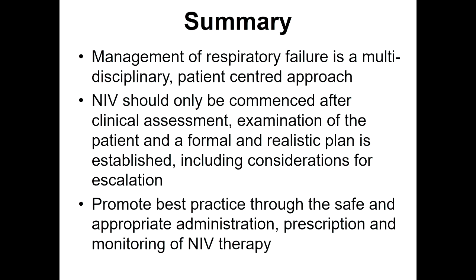In summary, the management of respiratory failure is a multidisciplinary patient-centered approach. Non-invasive ventilation should only be commenced after appropriate clinical assessment, examination of the patient, and a formal and realistic plan is established. And included within this is the escalation plan should the patient fail on this therapy.